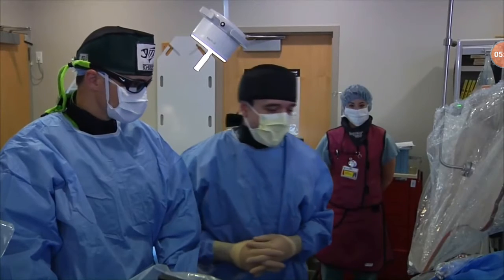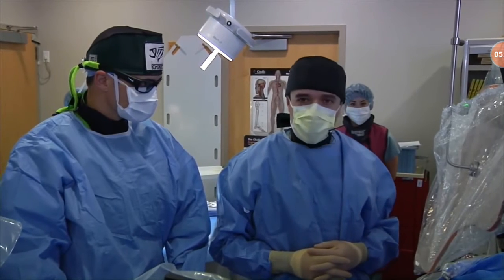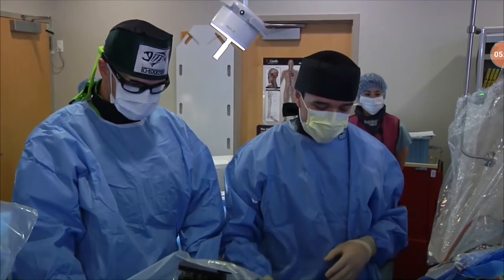Okay, hi everyone. We're starting here our first case of the day. I'd like to introduce our team here. We're going to do a CoreValve Evolut R here, 29.